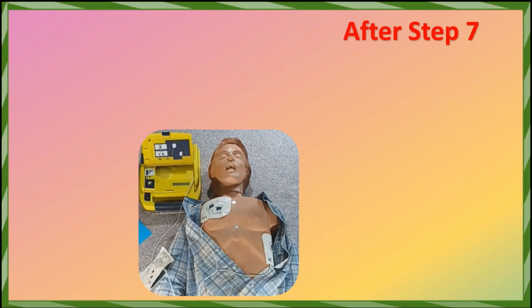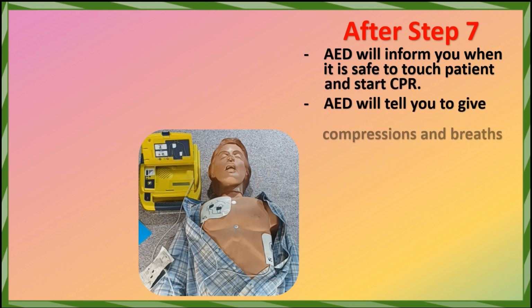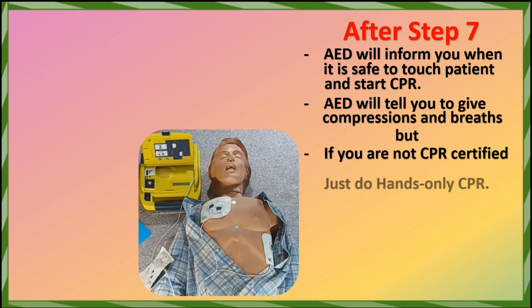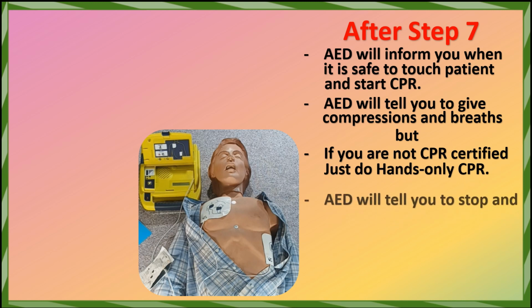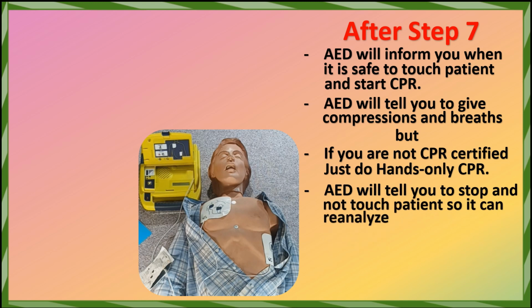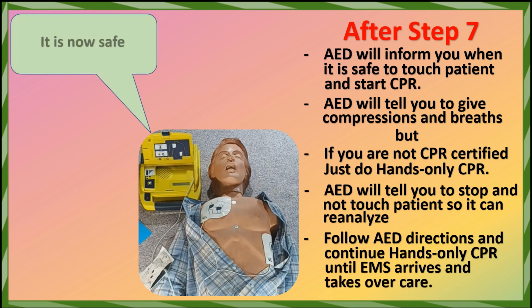After step 7, the AED will inform you when it is safe to touch the patient and start CPR. It will tell you to give compressions and breaths, but if you are not CPR certified, just do hands-only CPR. The AED will tell you to stop and not touch the patient so it can reanalyze. Follow AED directions and continue hands-only CPR until EMS arrives and takes over care. It is now safe to touch the patient. Start CPR.